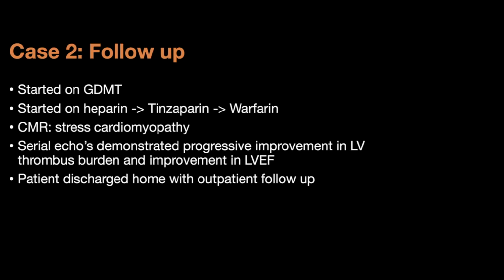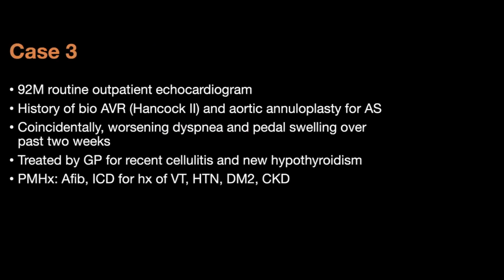And didn't have complete resolution. I didn't get into the details, but up to 20% of patients with Takotsubo may not have recovery in their LV function. She might, maybe in 6 weeks and plus, but there's a possibility that they might not completely go back to normal. All right, case number 3.